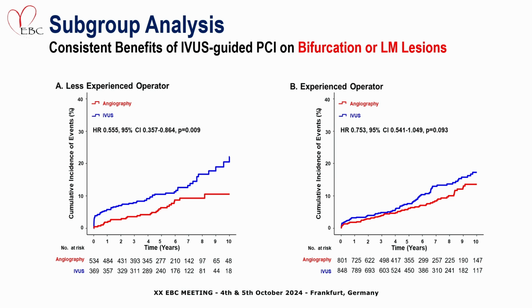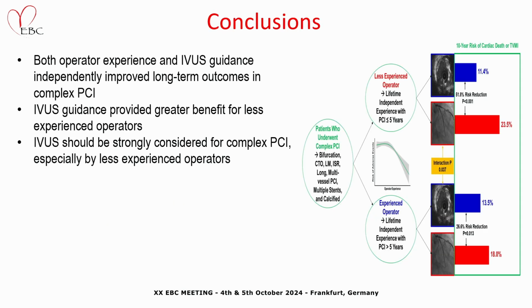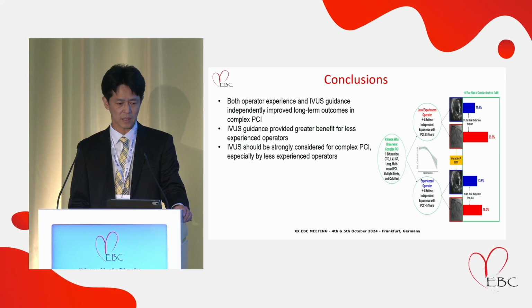particularly challenging lesion subsets, IVUS should be used. So, ladies and gentlemen, this is my conclusion. Both operator experience and IVUS guidance independently improved long-term outcomes in complex PCI. IVUS guidance provided greater benefit for less experienced operators, so IVUS should be strongly considered for complex PCI, especially by less experienced operators.